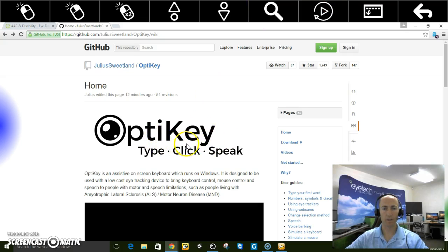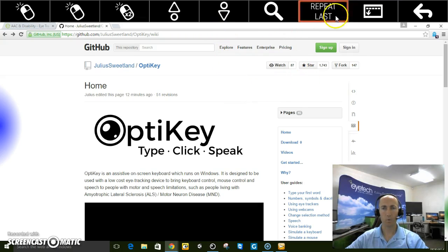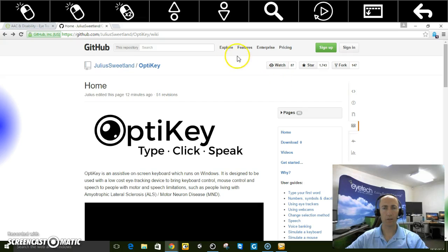But it's great for typing, mouse clicking, and also for speech. So you can stay in touch with family and friends and control your entire Windows computer.